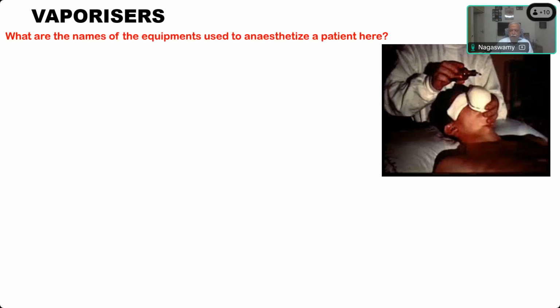One common question in those days, we used to get an examiner from All India Institute Delhi called Dr. Gode, and he used to ask the students, we all used to wear white coat when we go for the exams, isn't it? So the examiner used to ask the student, can I cut a piece of your white coat and use it in the Schimmelbusch mask for anesthetizing the patient by this method?